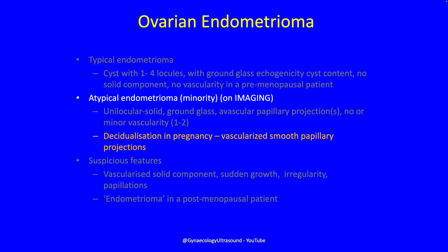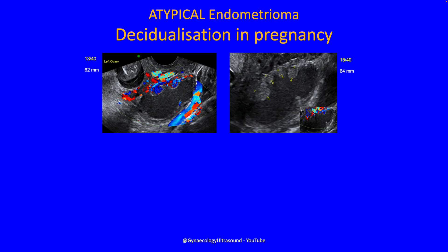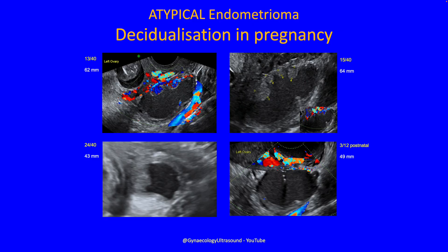The second kind of atypical endometrioma is decidualisation in pregnancy, described as vascularised smooth papillary projections. This patient at 13 weeks gestation had a unilocular solid cyst with strongly vascular papillae. At 15 weeks they had enlarged and become more vascular. At 24 weeks the papillations had all but vanished. At 3 months postnatal it was clearly an endometrioma with the papillations gone, and cystectomy confirmed a benign ovarian endometrioma.